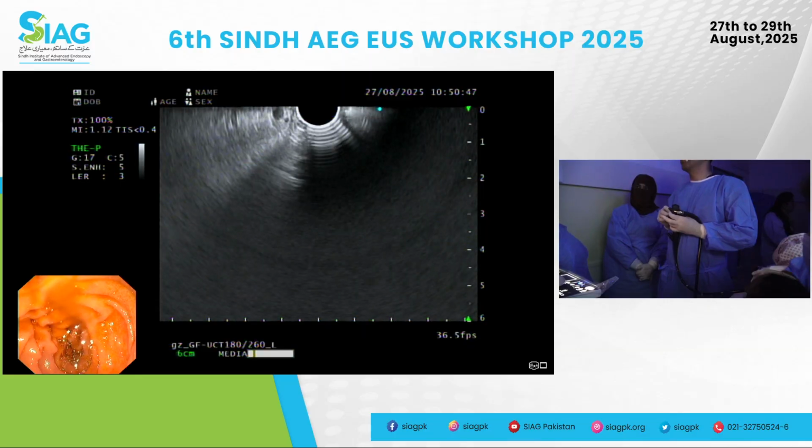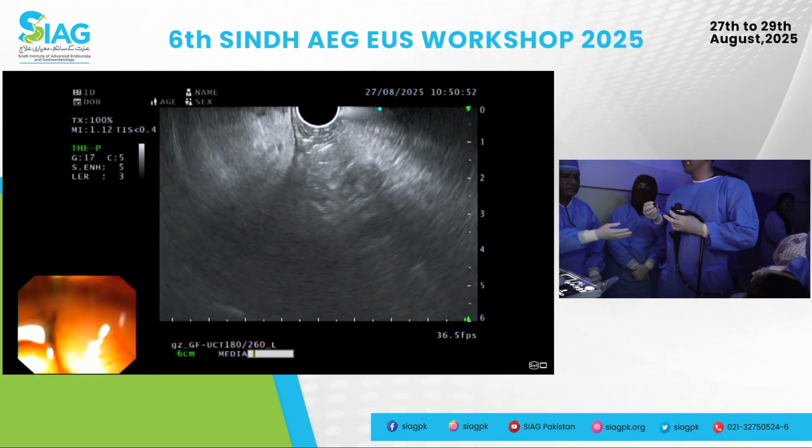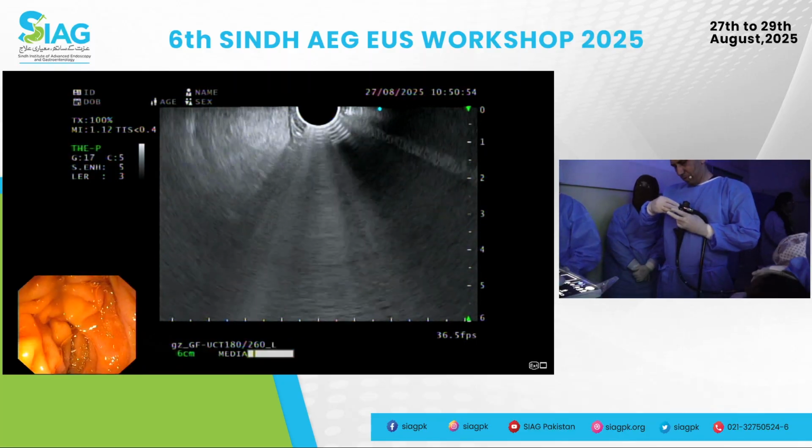It's okay. I've just taken the suction button off. Okay, good.